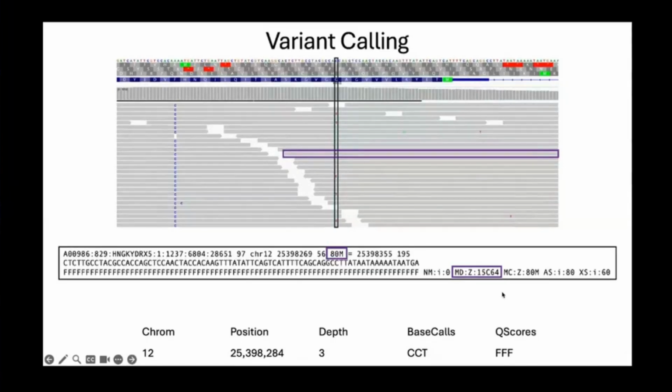As a clinical lab, we should be focused on producing a reliably satisfactory amount of data for each sample. So we should be in a position to comfortably let the low quality stuff go. And I think that's the best way to get high quality results, and it's going to make both the validation process and the clinical service run more smoothly.